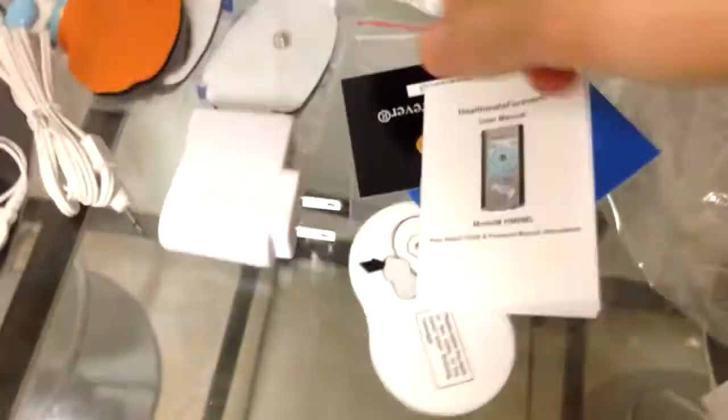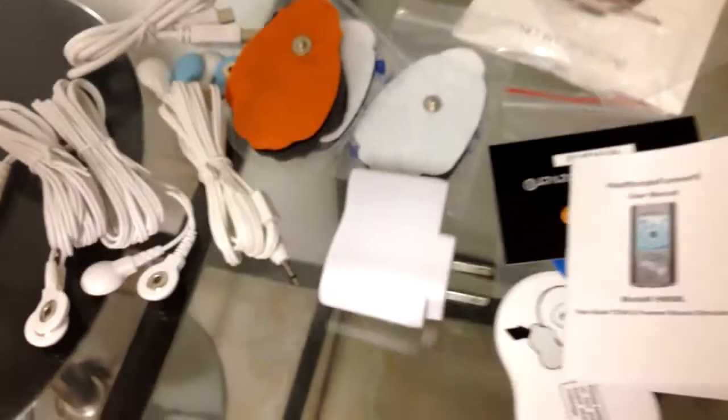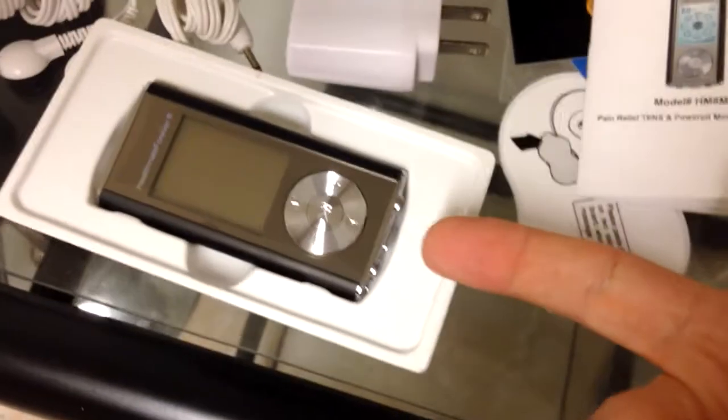Overall components here — you get a lot of stuff in this small package. It almost is like getting an iPod — it looks just like an iPod, it's crazy.